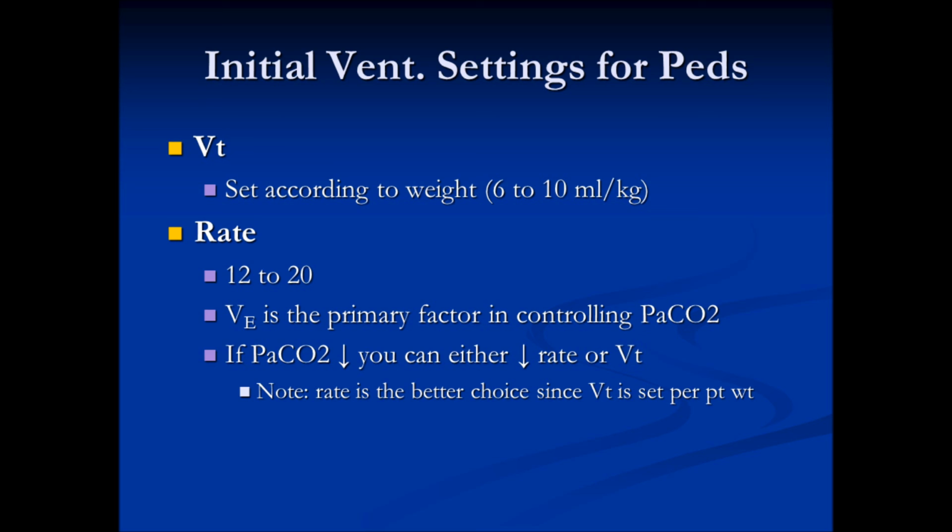But the reason we don't adjust tidal volume is because we set it to the patient's ideal body weight. And if the patient isn't changing their sex and getting any taller, then they are going to stay at whatever tidal volume you initially set them at. So always make sure, when you are taking your test, that the tidal volume they gave you initially was set by the patient's ideal body weight.